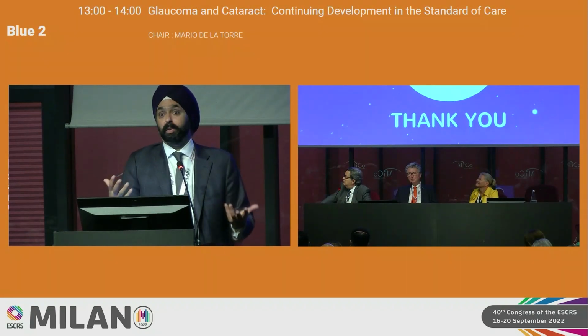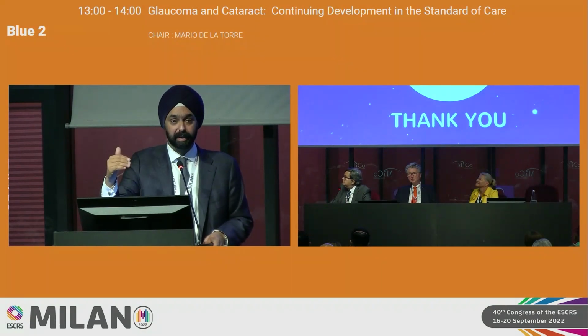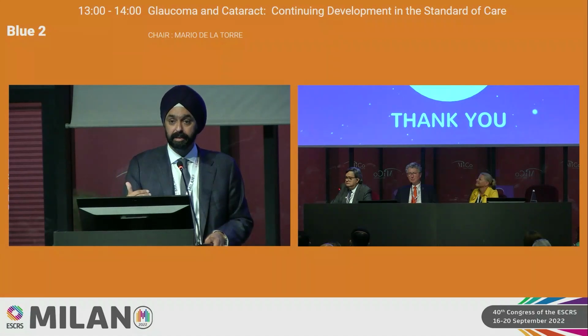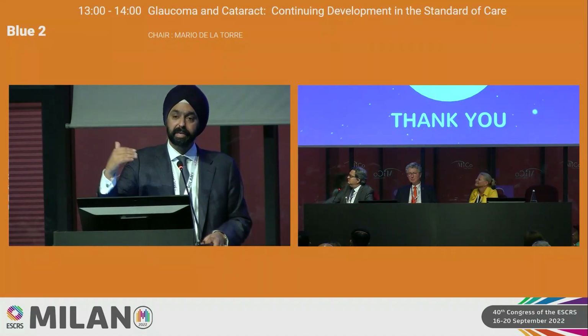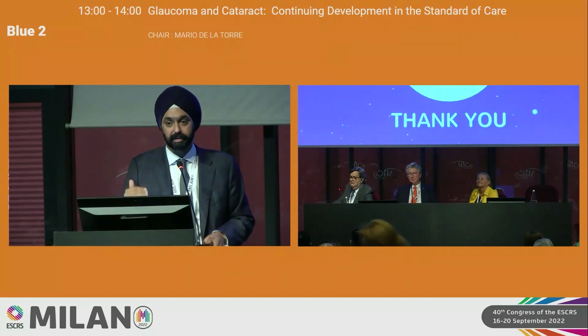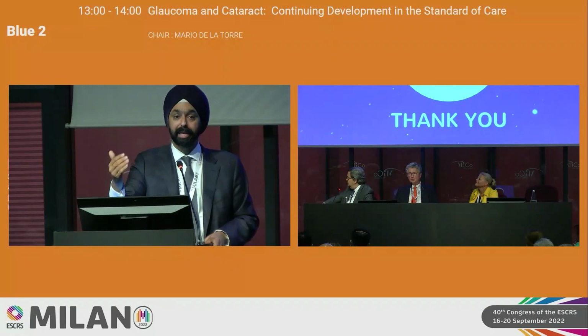We have something called the iStent Infinite trial with Glaucoma showing us that those 3 stents have significant efficacy. And SLT can benefit. Now, you may have a little bit less efficacy in some patients, no doubt. But the safety being so high, it's still worth it to maybe get them off of 1 drop. It won't get you down to a target pressure of 10, but it can get you some reduction as well. So it's worth a try, even after MIGS.